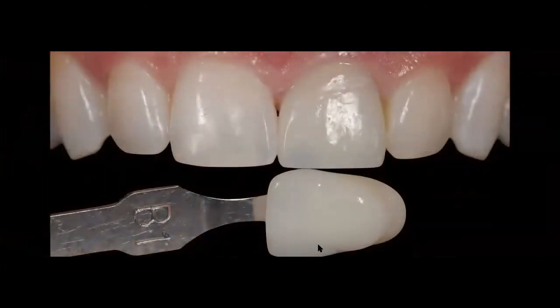Now, this is the B1 shade tab color that I had sent to the lab. Same B1 that I used to take the photo right here on this tooth. And I'm taking another photo just to communicate to the lab why I was unhappy with the final restoration. When you look at this photo, look at the gray compared to the natural tooth, and look at the gray compared to B1. So this ceramic restoration doesn't even match the actual shade tab that I'm using to select my shade, or at least to approximate a shade to the lab and have him understand where we're at.